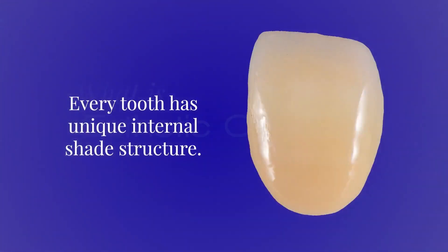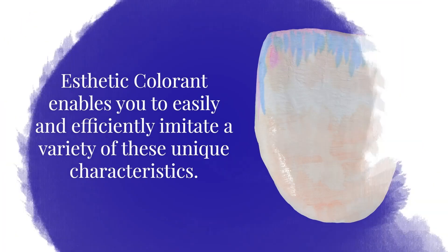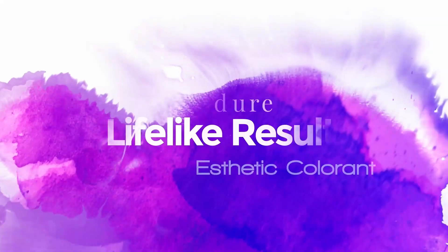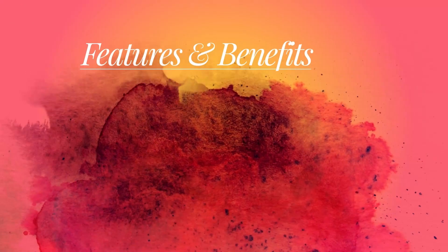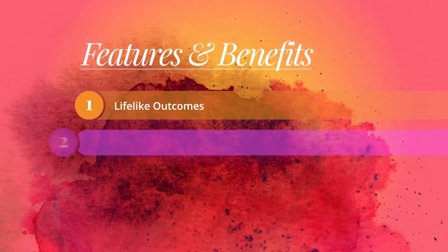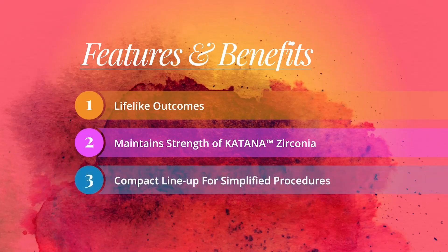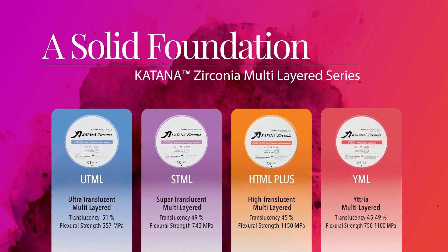Every tooth has unique internal shade structure. Aesthetic colorant enables you to easily and efficiently imitate a variety of these unique characteristics. Aesthetic colorants are easily applied to the milled restoration using a liquid brush pen. Aesthetic colorant needs a solid foundation — it is designed for Katana Zirconia Multilayered Series.